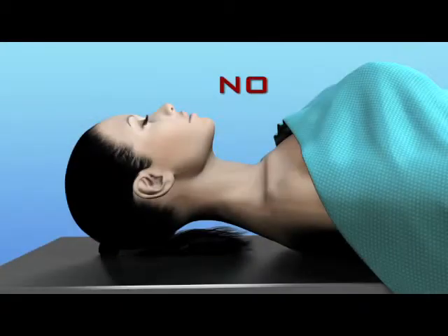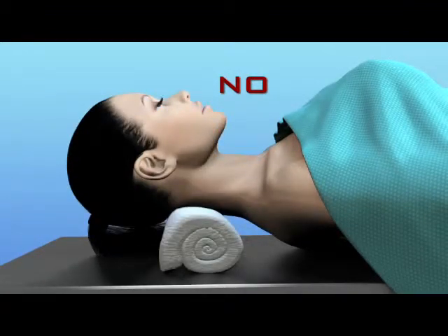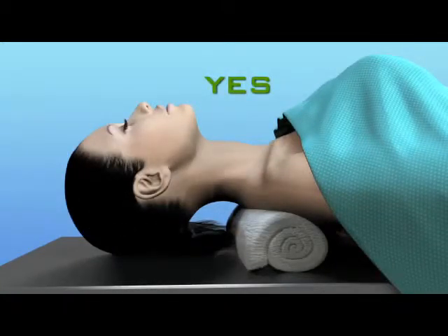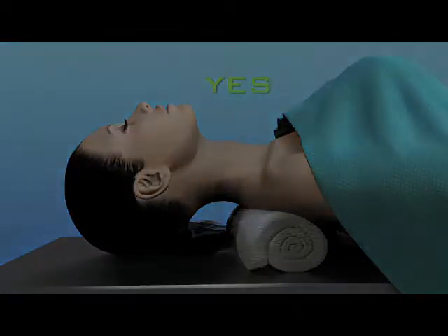As in all neck cosmetic procedures, it's important to have exposure and visualization. This animation demonstrates the various places of a pillow that will help extend the neck. The best place is underneath the shoulders, thus allowing the most extension of the neck.